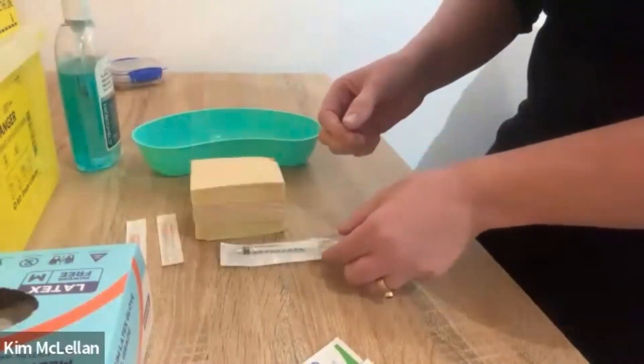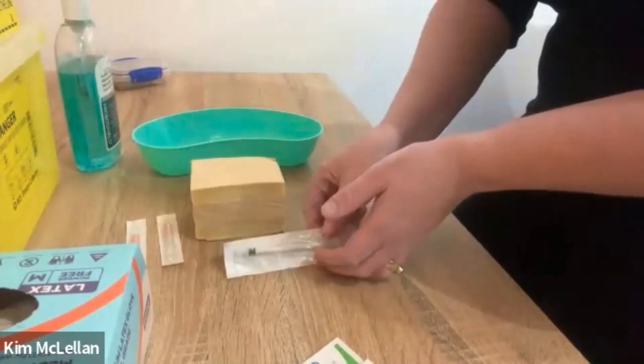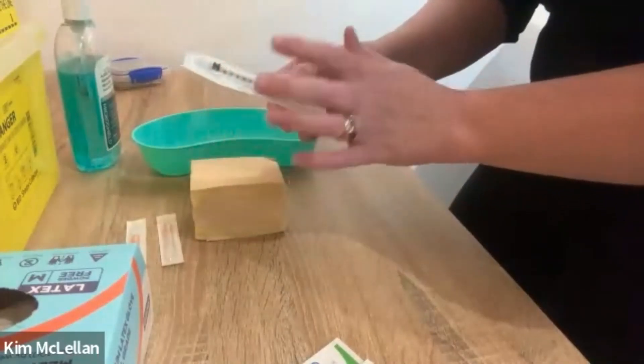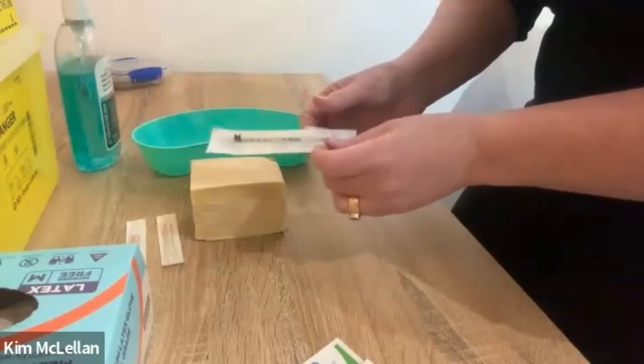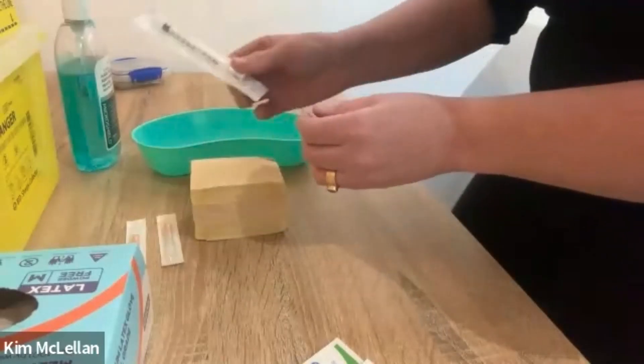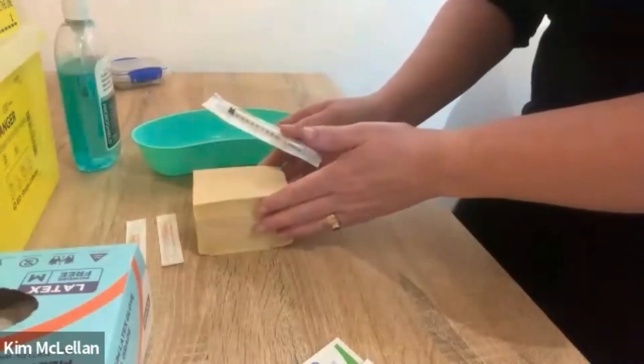If you have a proper insulin syringe and that's what's being provided, then of course you just draw up the number of units. So if it's 30 units, you just draw up 30 on the insulin syringe. However, I just have a one mil syringe, so we're going to use that, which means it's 0.3 mls.